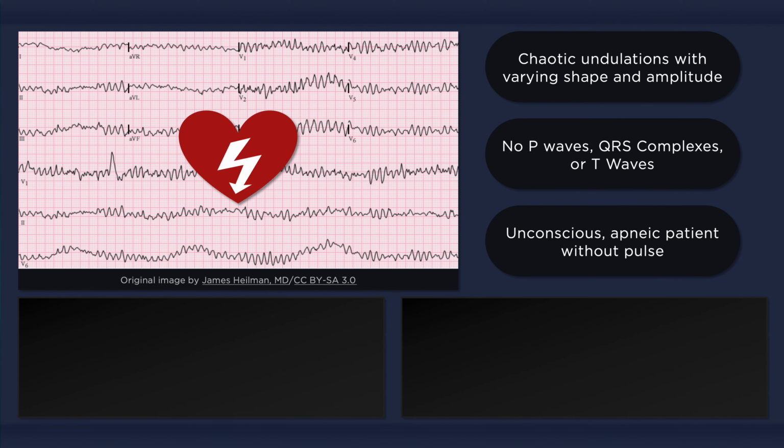Fortunately, ventricular fibrillation is one of the shockable rhythms. Cardiopulmonary resuscitation should be provided while a defibrillator is being obtained, and a shock should be delivered once the rhythm is identified. Following the shock, CPR should resume for 2 minutes before another pulse and rhythm check is performed. To reiterate, CPR commences immediately after the shock is delivered. It is essential to keep interruptions in CPR to a minimum. For more information on management, please check out the latest ACLS algorithms.